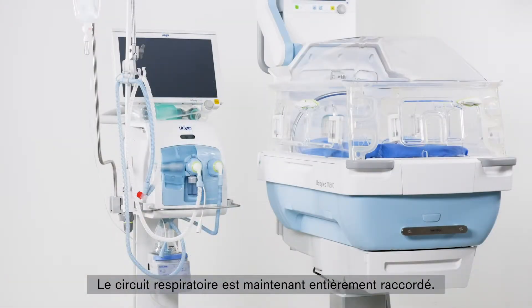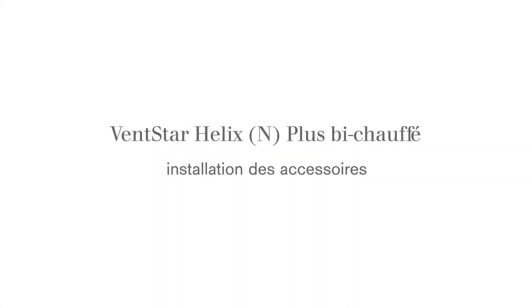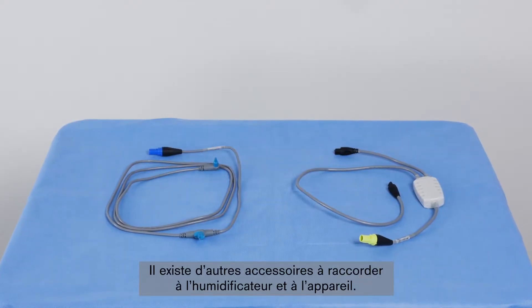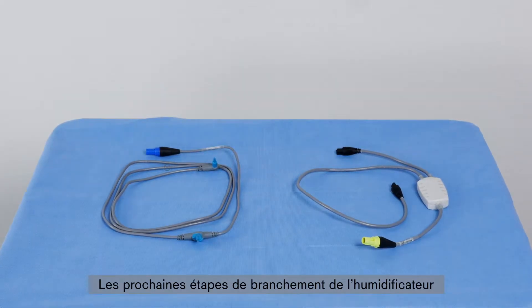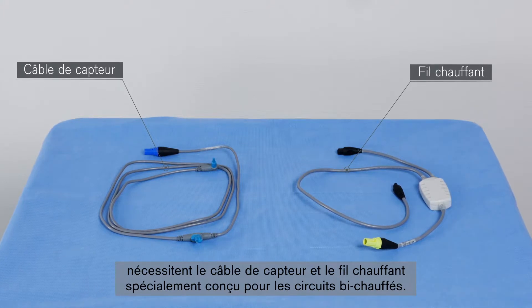The breathing circuit system is now fully connected. In addition, there are further accessories to be connected to the humidifier and the entire system. For the next steps in the setup of connecting to the humidifier, you will need the sensor cable and the special heating cable designed for dual-heated systems.